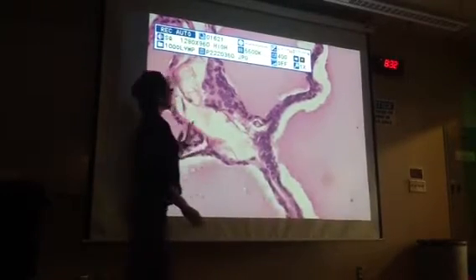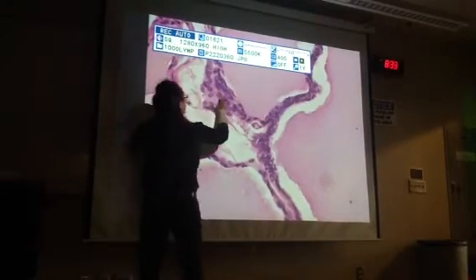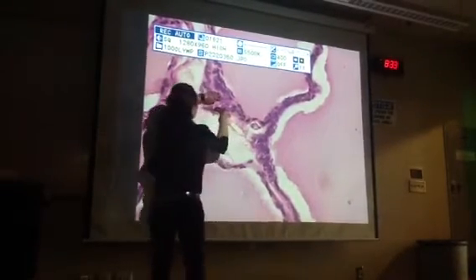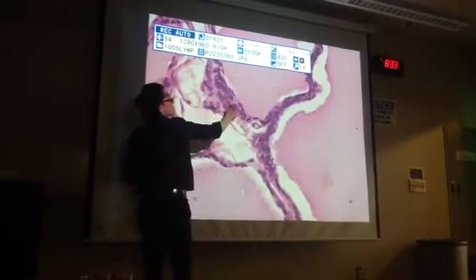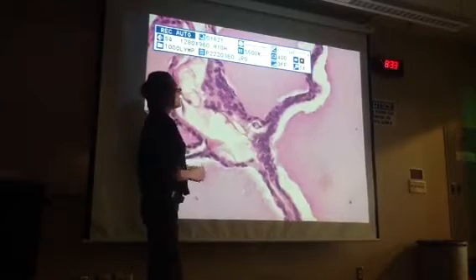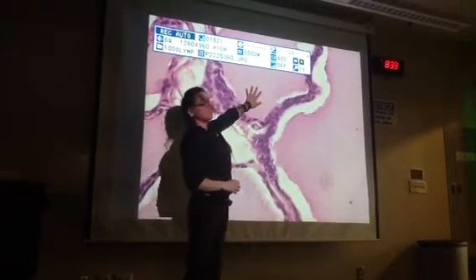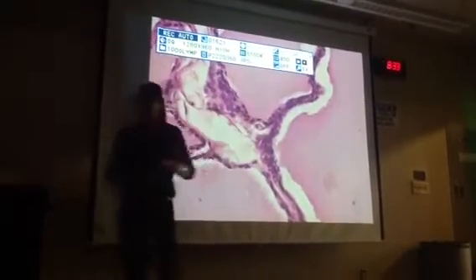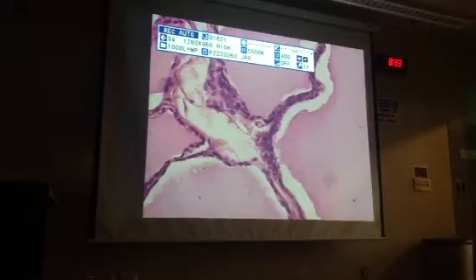And then anywhere in between, these cells here are in between this follicle and that follicle. These would be your C cells or your parafollicular cells. These guys would be releasing calcitonin. These would be releasing your thyroid hormone. For that one, it's going to be best to see it at either 10x or 40x.